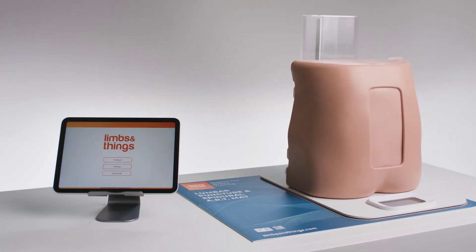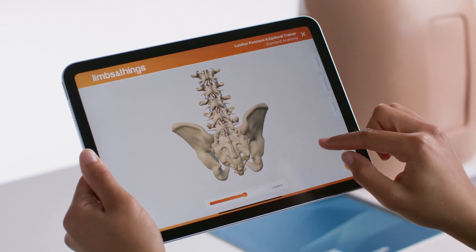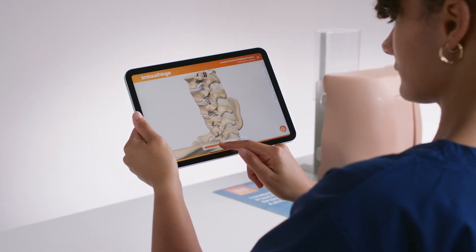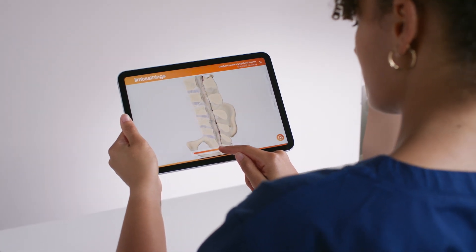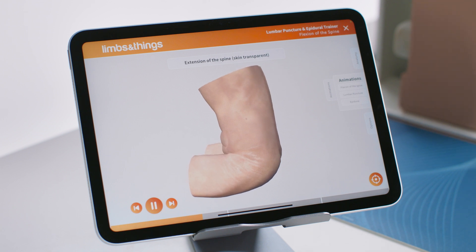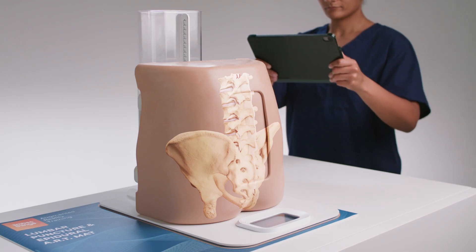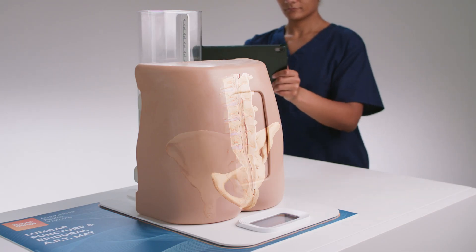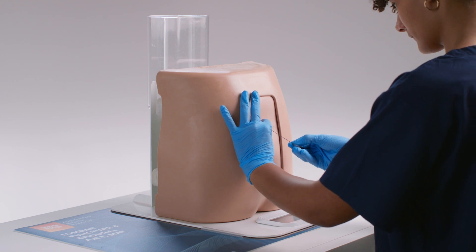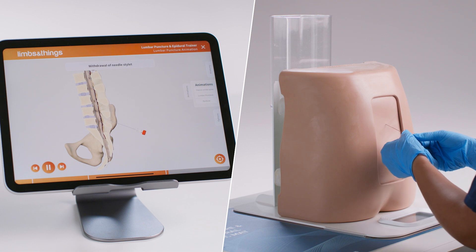Compatible with LIMS ART Augmented Reality Training, allowing trainees to view the internal anatomy of the lumbar spine and surrounding structures, increasing anatomical and procedural knowledge. The interactive anatomy gives the ability to view under the skin with normal and pathological anatomy, animations showing flexion of the spine as well as epidural and lumbar puncture procedures. Augmented Reality overlays the internal anatomy and animations onto the product, giving a new immersive dimension to training. Visualizing the different layers which are passed through during the procedure gives visual guidance to complement the haptics of the model.